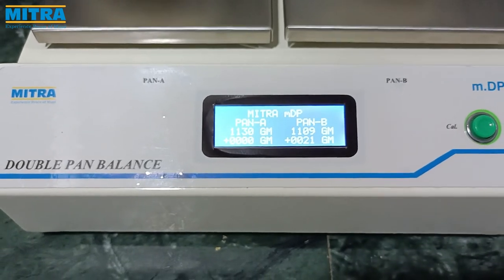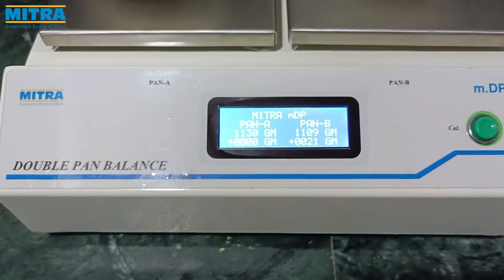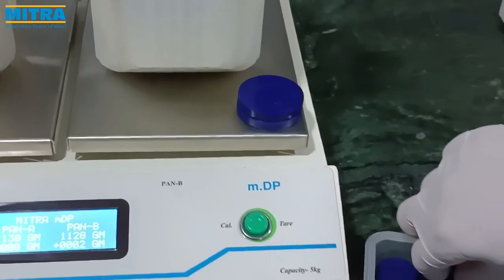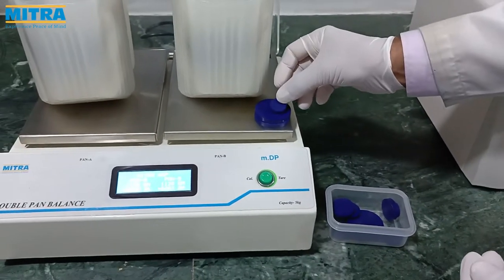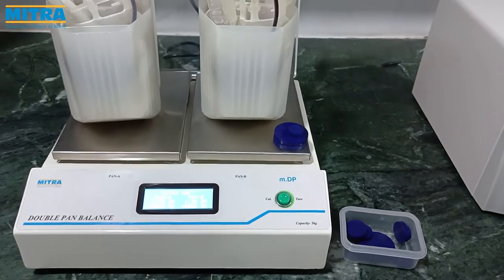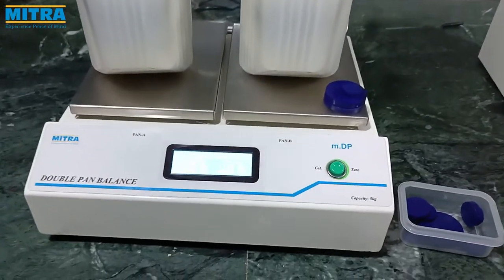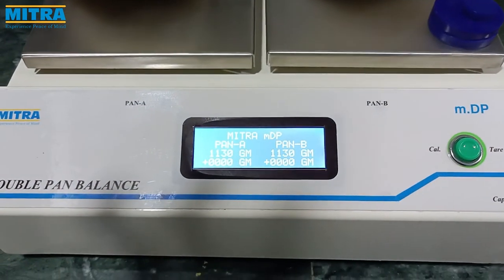The screen display also shows how much weight must be added to a bucket to balance the weight of both buckets. When both buckets are equally balanced, a beep sound is heard. Now that both buckets are balanced, you can proceed to the centrifugation process.